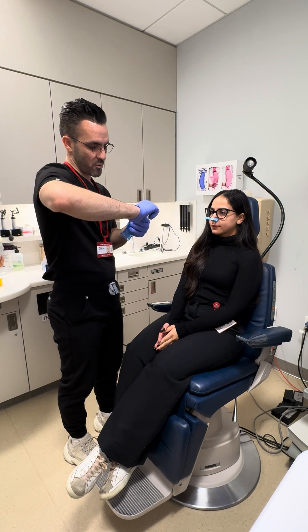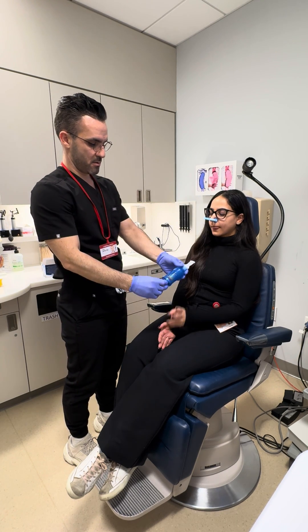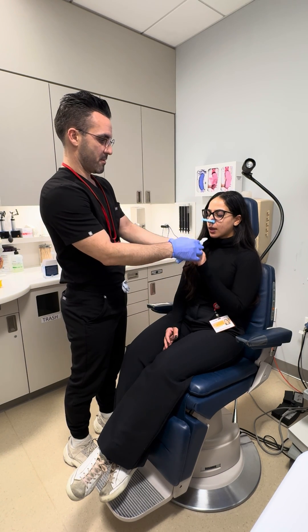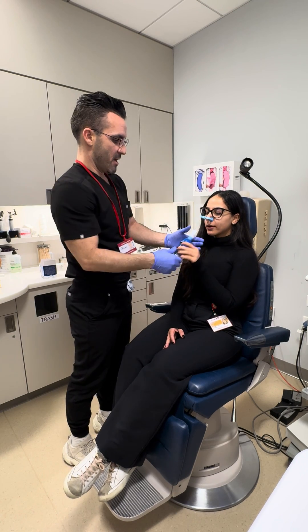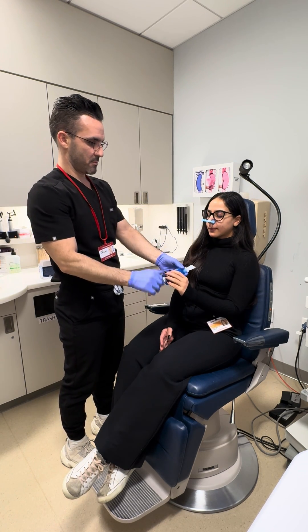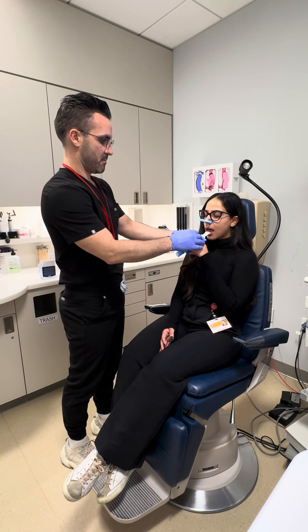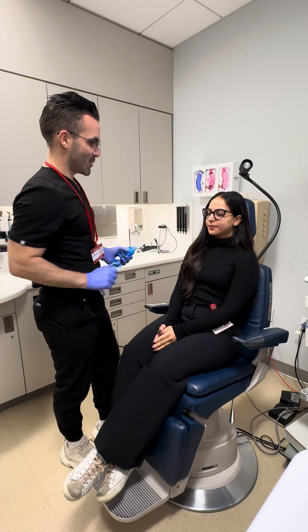Make it a little harder again, back to 90. Low. Stop, bite, suck in — more, more, good. Relax. I'm going to make it a little easier now, bring it down to around 80. Low. Stop. Suck in. Good. All right, good work!